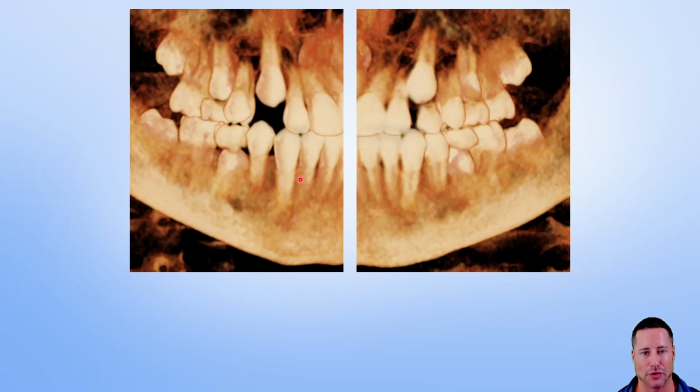C had now naturally exfoliated, and that's how much space, and that's how the canines, which I'll be teaching you in, there's significant content on the doc website in the CE courses that I've referenced, as well as future podcasts. We'll be talking more about this. But the amazing approach I have, you can see her anterior crossbite is gone, as is her posterior crossbite, and the canines are now erupting nicely without ever having to even extract any primary teeth. And we did not use expanders to do this. So giving you a little bit, or for those of you who have taken the courses, you know what I'm talking about. For those who haven't, you've got some cool things that are going to be coming your way.